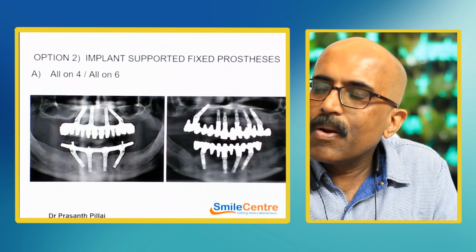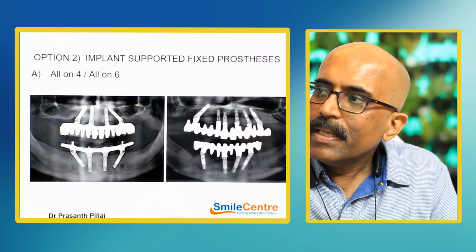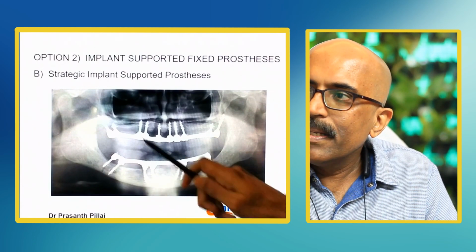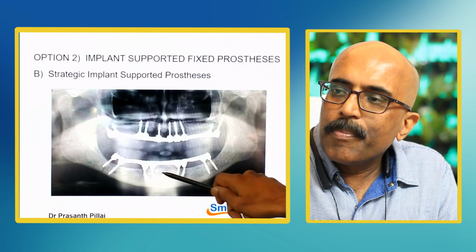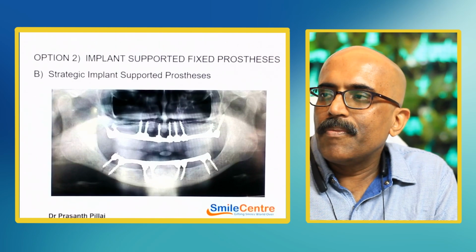Now the cantilevers are not really going to be helpful in the long run, because you can always have lopsided force acting on the cantilever, thereby creating problems for the implants. But here there are no cantilevers at all, so we avoid cantilevers altogether. And these implants are placed employing keyhole procedures. There is no open surgery, and we don't do any bone grafting, which is an added advantage.